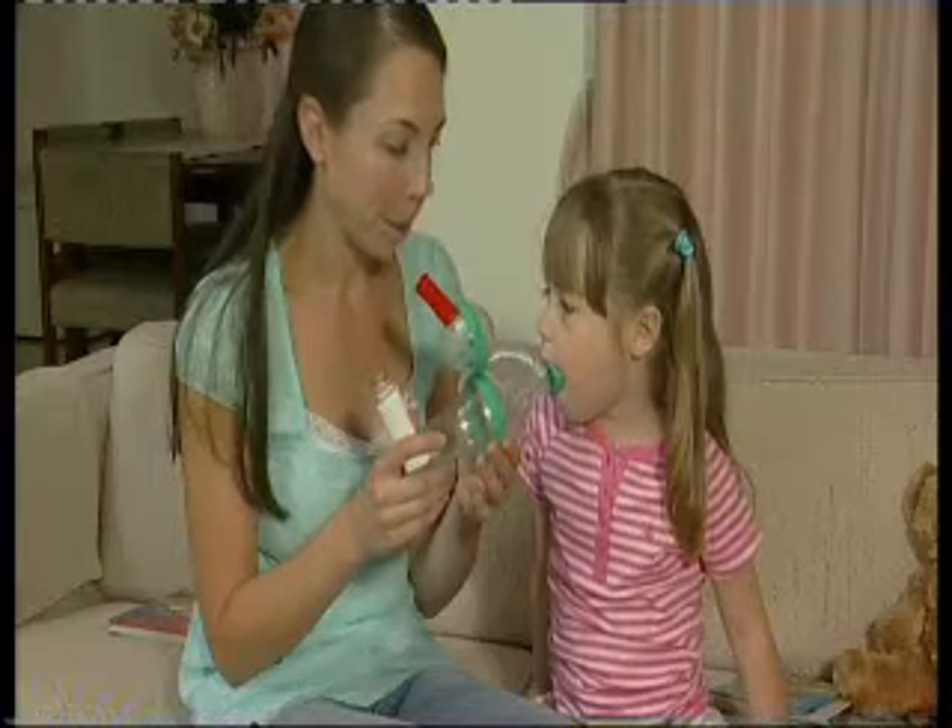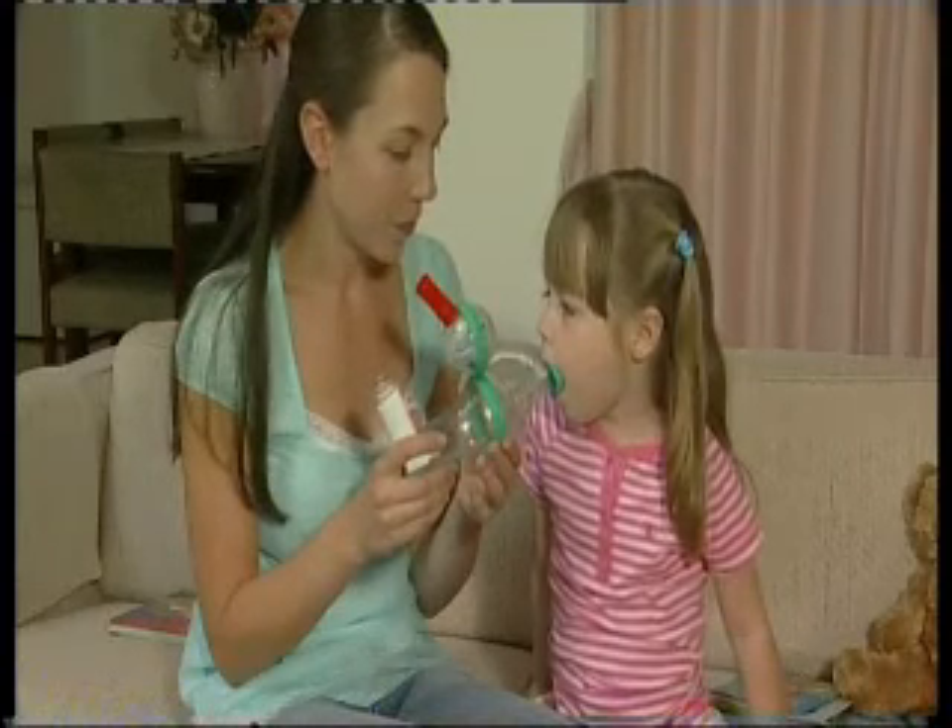You will see the green coloured valve in the Funhaler open and close, indicating inhalation and exhalation. When the child breathes out, the disc will spin and the whistle will sound.